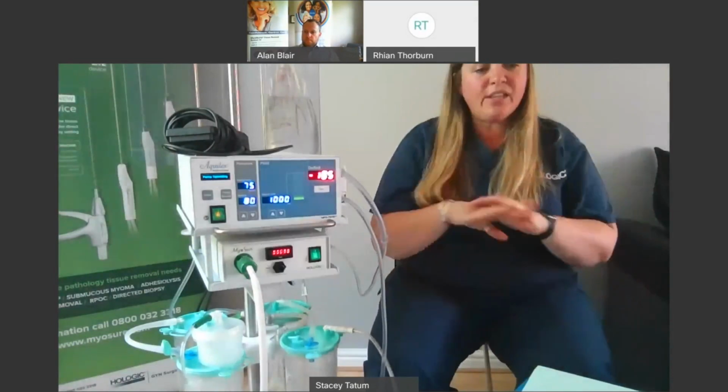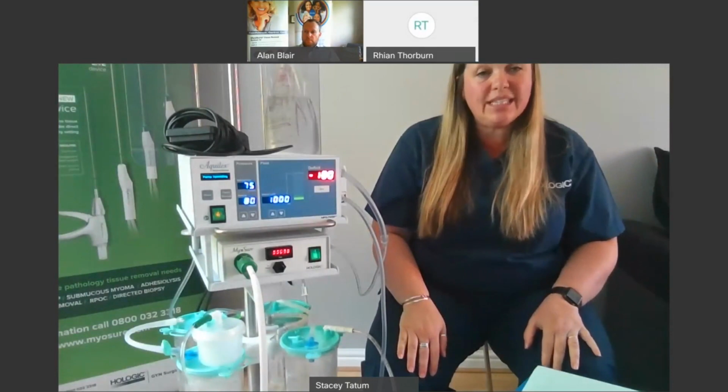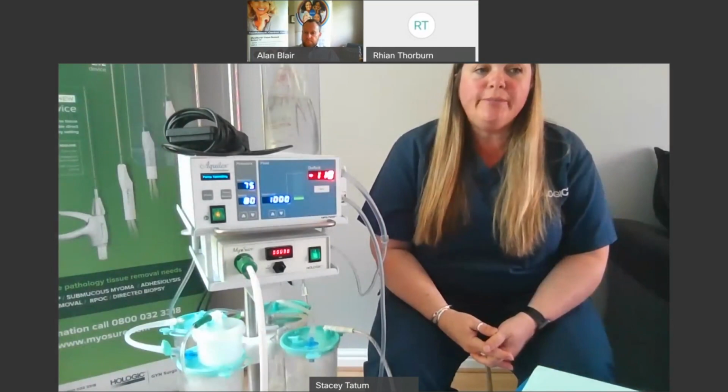And if you've checked all that, there's no fluid on the floor, there's no fluid underneath the patient, then you have to assume that high fluid loss is in your patient, and it would be up to the surgeon whether they carry on or abort.